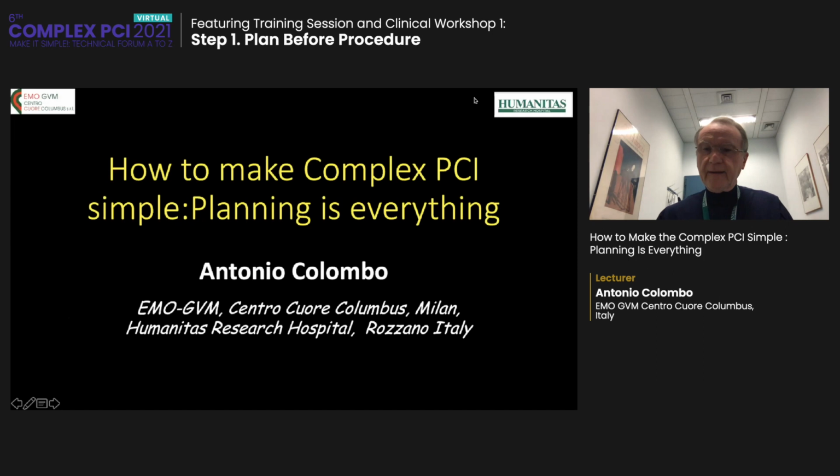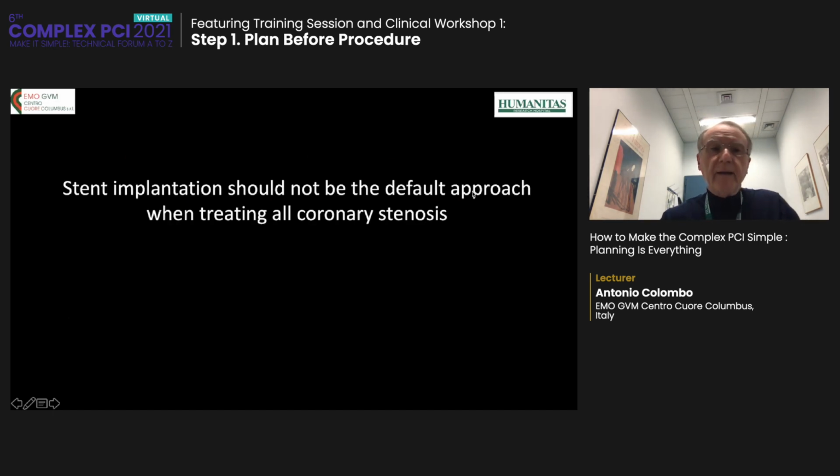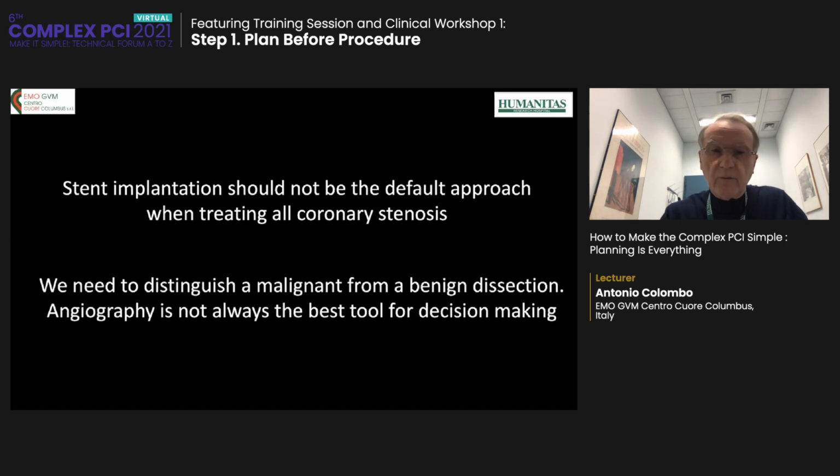I think it is time to make a little bit of a shift in our planning and the way we do angioplasty. And I want to start with this statement. Stent implantation, I don't believe, should be anymore the default approach when treating any coronary stenosis.